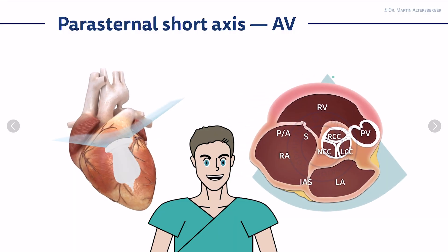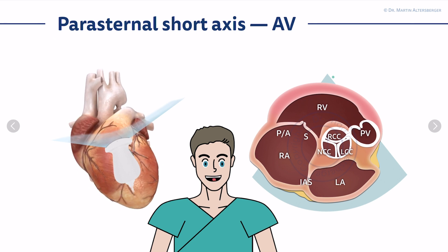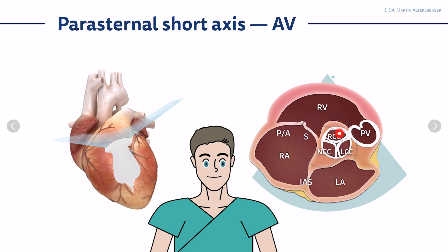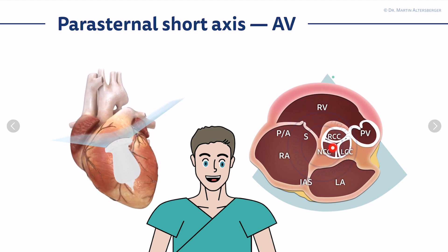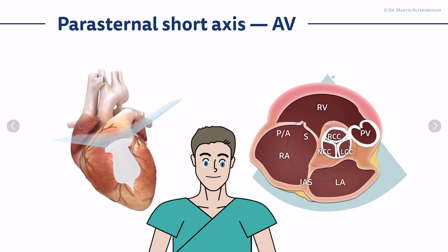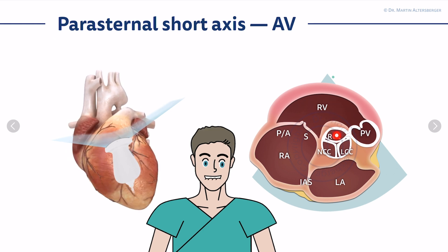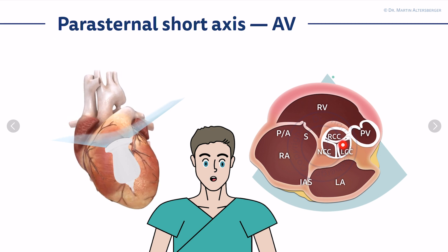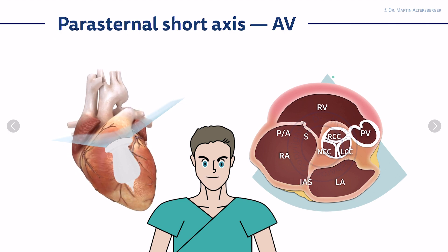In the first views of the parasternal short axis, we focus on the aortic valve. The aortic valve has three cusps: the right coronary cusp, the left coronary cusp, and the non-coronary cusp. The orientation is easy to remember: the right coronary cusp always points towards the right ventricle, the left coronary cusp towards the left atrium, and the non-coronary cusp towards the interatrial septum.